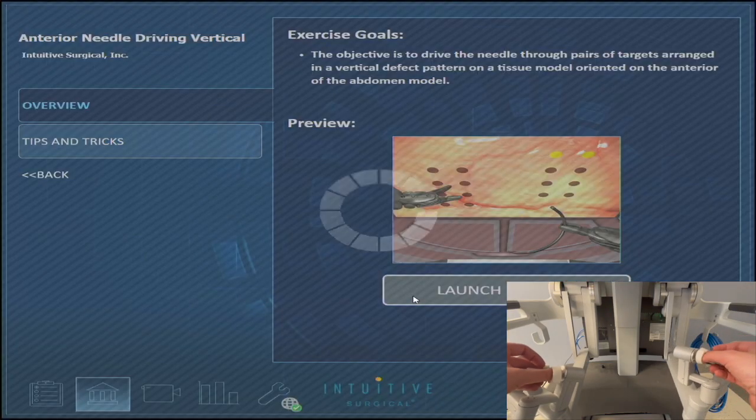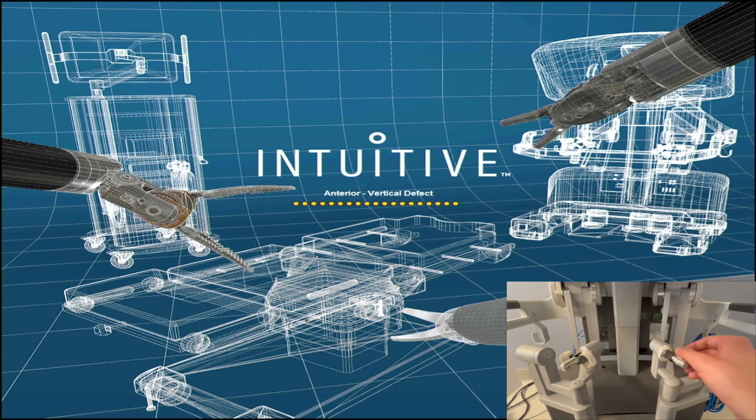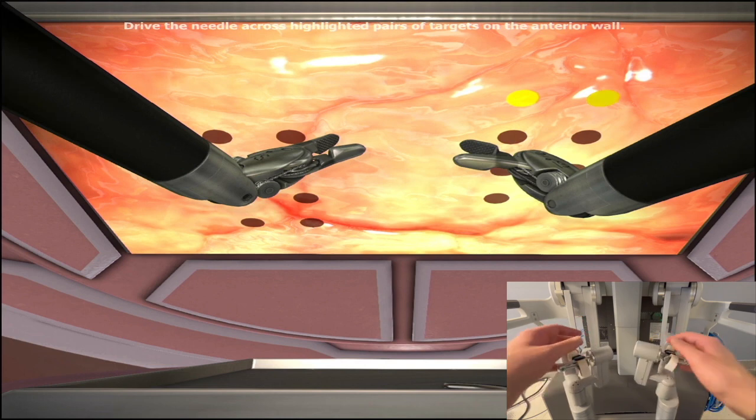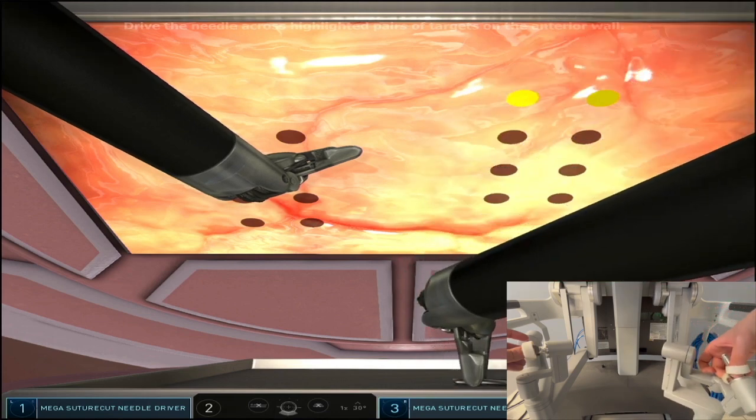Hello everyone, this is a video tutorial on the anterior needle driving vertical exercise on the robot. Similar to the horizontal variation, we're going to be taking bites sequentially using alternate hands.